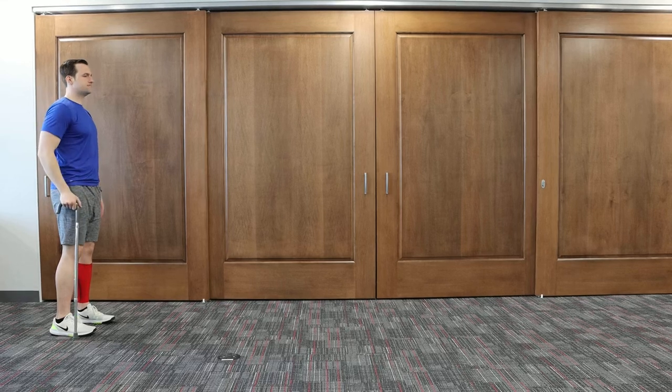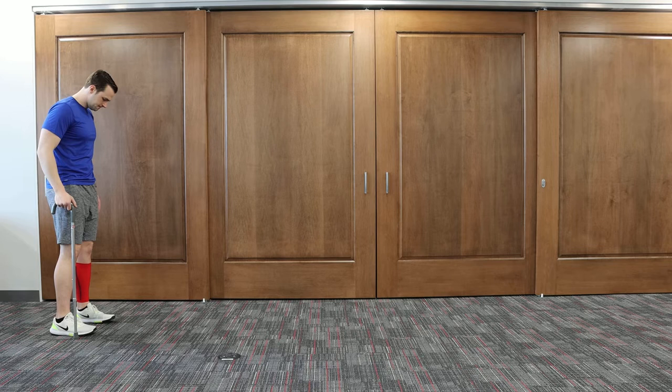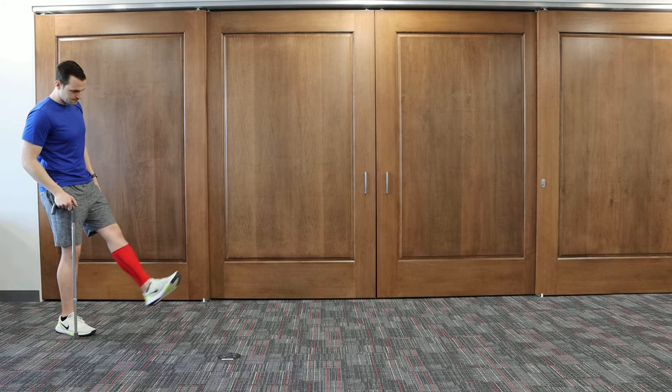In this video, we will be demonstrating the most commonly used gait patterns with a straight cane. For the purposes of this video, Matt's affected limb is his left lower limb, which is indicated by the red leg sleeve.